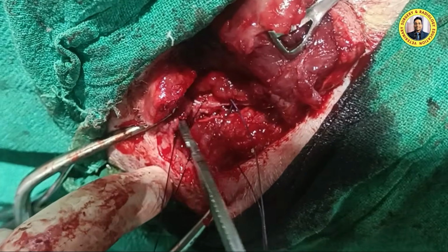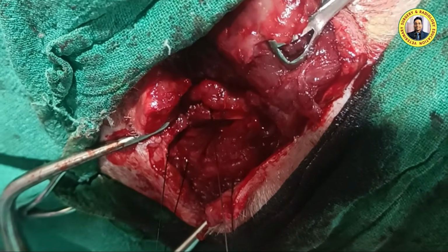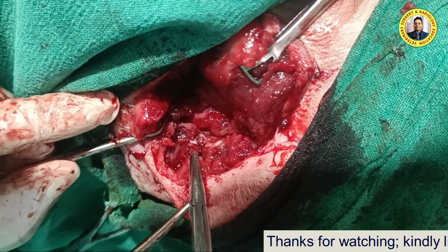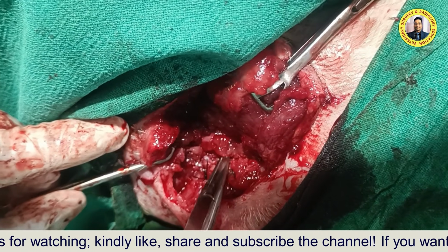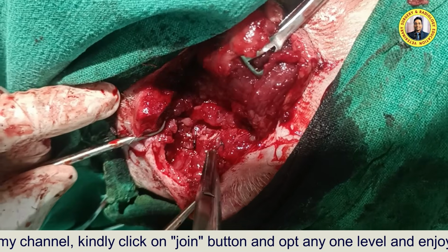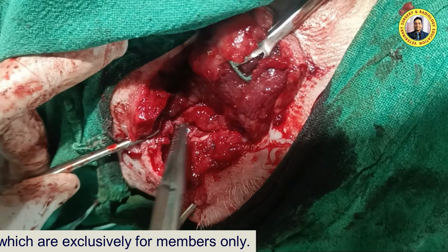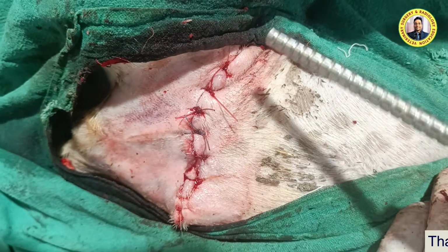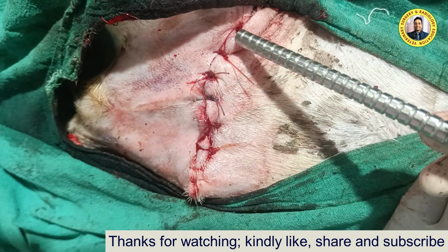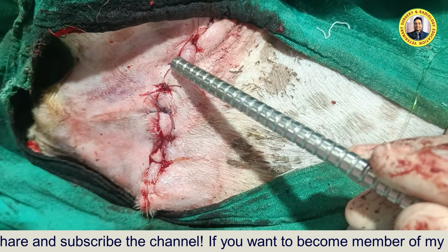We have pre-placed the two cross mattress sutures, so we will pull like this at the time of inflation of the lungs. Now you could see we have placed two sutures to close this opening into the thoracic cavity. We will further reinforce this by applying the muscles, and then we will apply the figure of 8 suture pattern since it is contaminated. Initially the wound was here, but we extended it here and here, so we prepare the skin along with the subcutaneous structure and muscles in a figure of 8 pattern using the nylon suture.